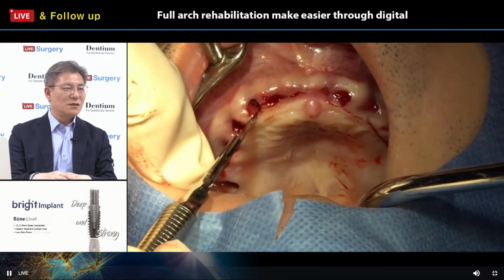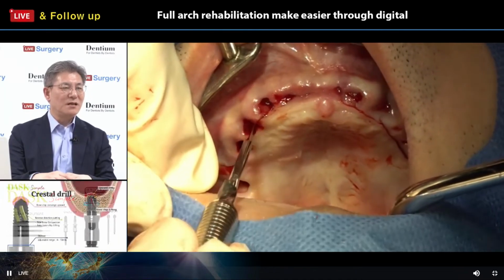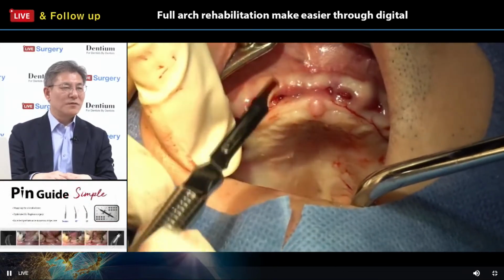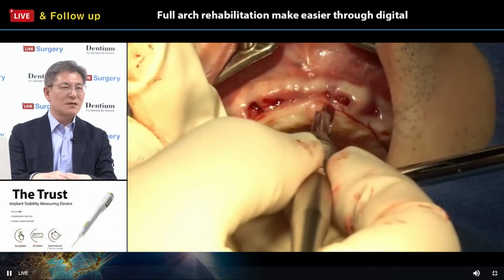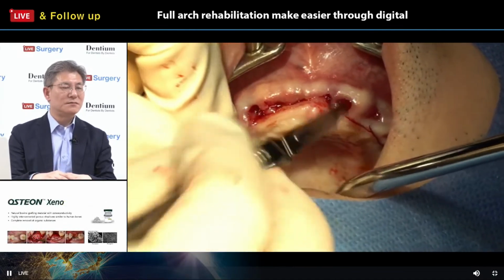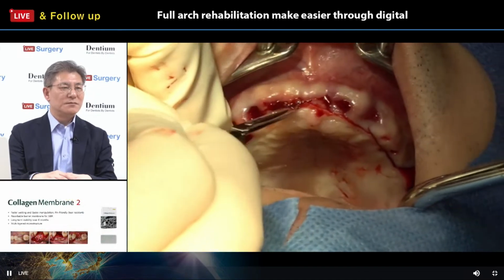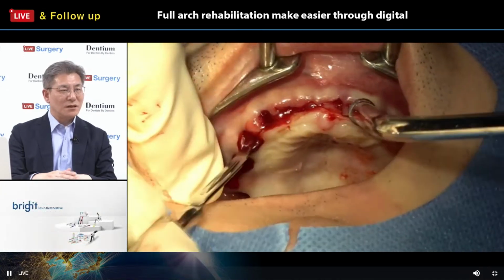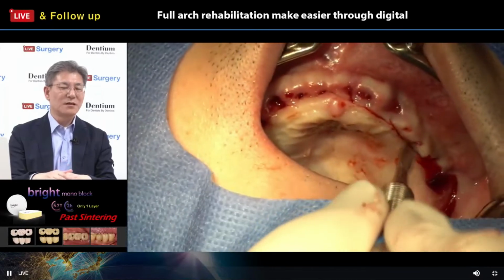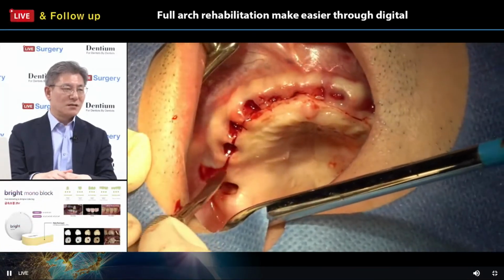So he is making the incision line a little bit palatally inclined. A palatally deviated incision is very important when you have upper jaw surgery, because it promotes flap reflection and provides a better surgical field. It makes flap management easier. Ordinarily, the incision line should be 2 millimeters parallel to the ridge crest on the upper jaw, in an ordinary surgical field situation.